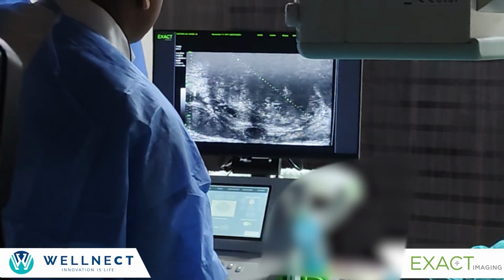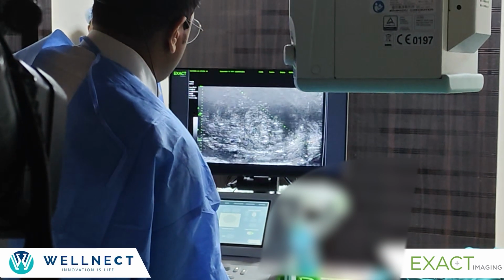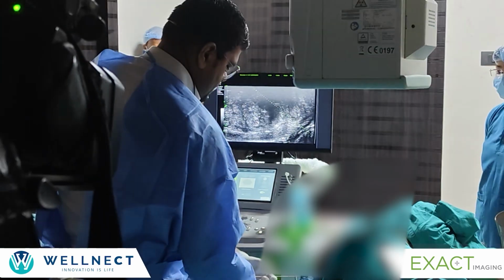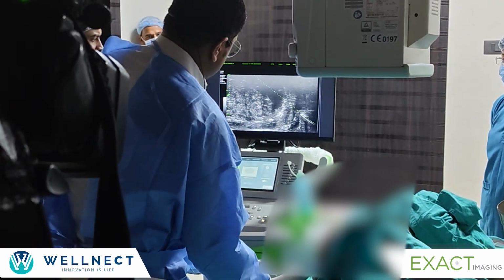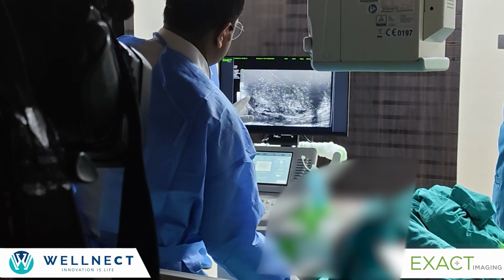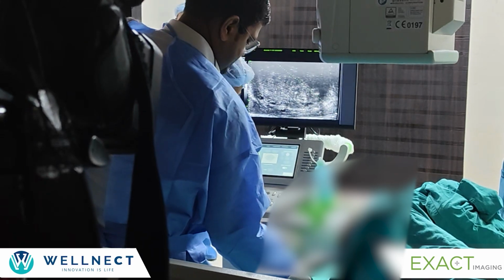Now you see this urethra. You see the urethra over here. Can you appreciate this catheter? Yes. Now I go on the other side. So this is base, apex, left parallel. I traverse to the prostate from here and fire. Now I go slightly up. Now this is midline, left parallel. I hope you are understanding the schema. Yes, sir.